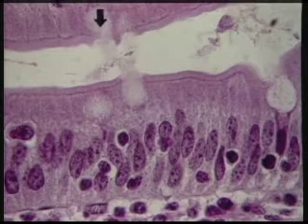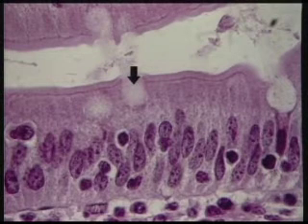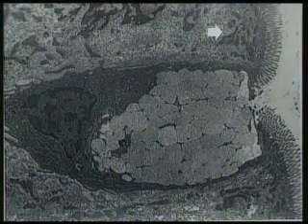Here's another one up here because much of the mucus has been extracted by specimen preparation, and it's shaped somewhat like a goblet, and its morphology can be seen even better with the electron microscope, as on the next image. This is an electron micrograph taken from plate 1-3 of your visual histology text atlas, and the arrow is in one of the intestinal epithelial cells, the kind we just looked at, and you can see the individual microvilli right here. This is how they look in the electron microscope.